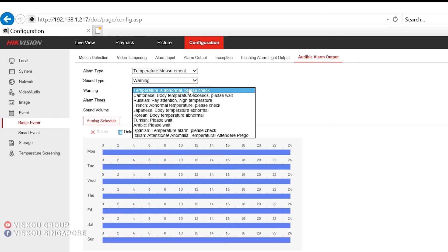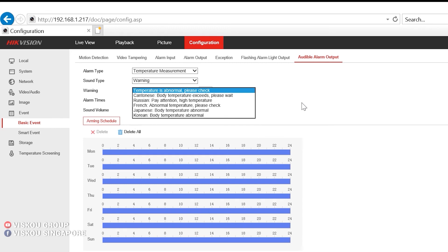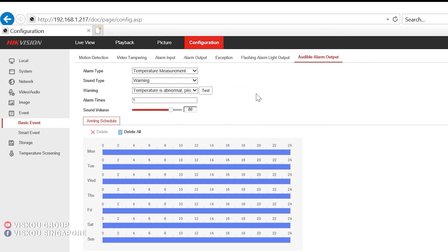Temperature is abnormal. Please check. Which is just now I showed in the demo section.